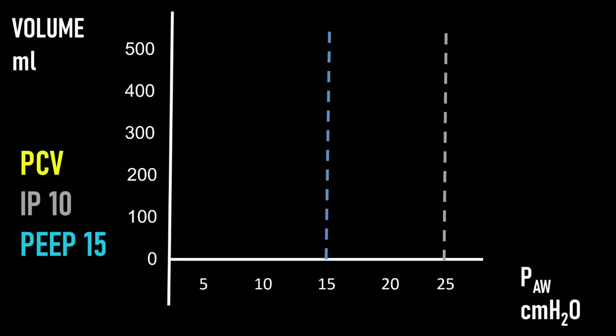While constructing these static volume pressure curves sounds great and it looks cool when you read about it in journals, doing it in practice is quite tricky, and of course very few people actually do this for lots of reasons. One, you need the equipment. Two, you need the skill. And three, you need to have nerves of steel, because these are the sickest, most hypoxic patients that you will encounter, and they desaturate very quickly. I do not create static volume pressure curves in my practice.